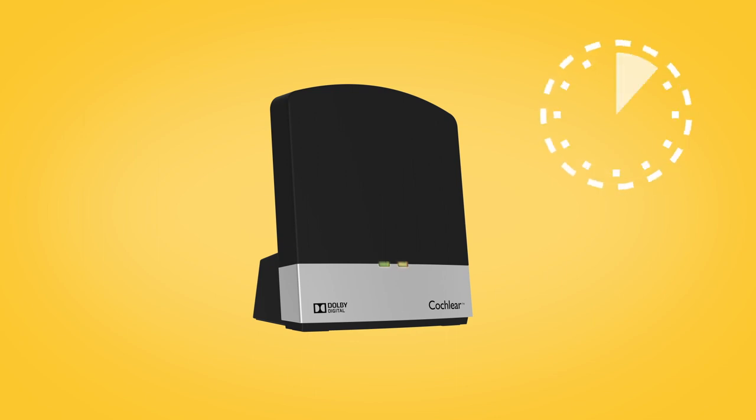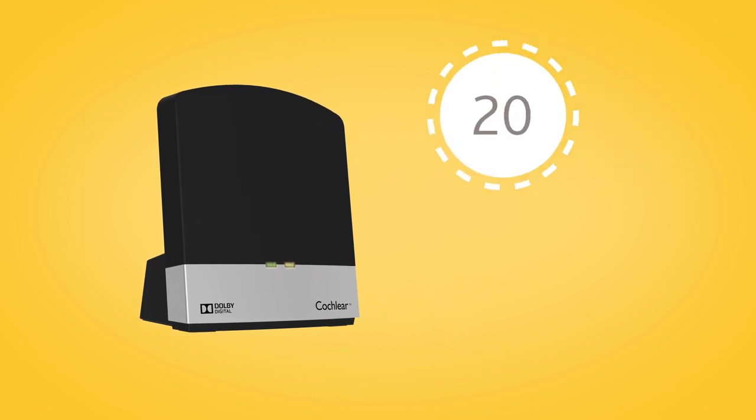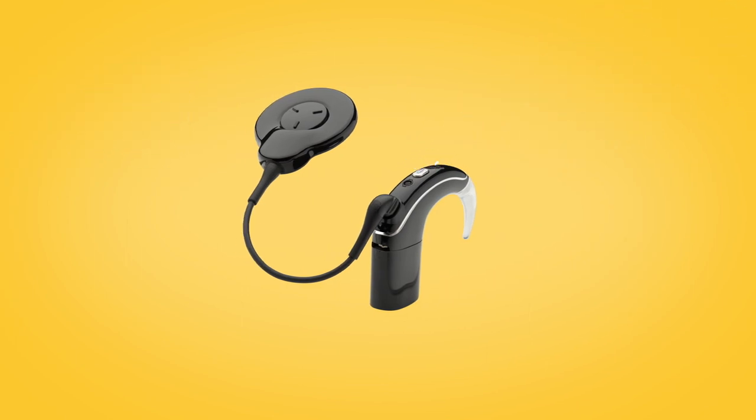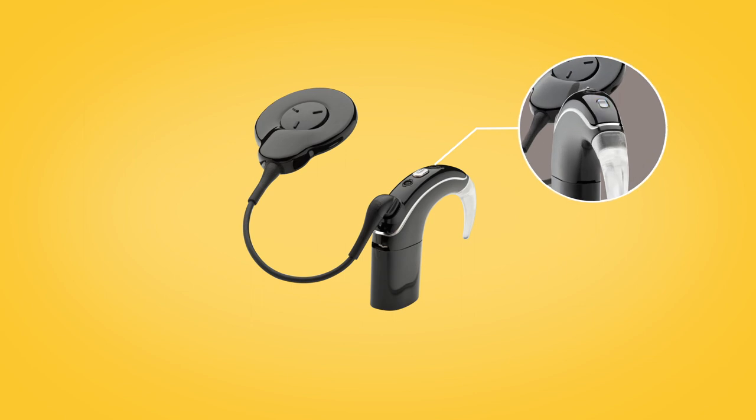Pairing mode lasts for 20 seconds, during which you should switch on your sound processor. Your sound processor will briefly flash a blue indicator light to tell you pairing has been successful.